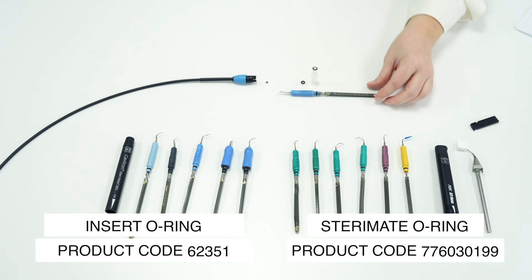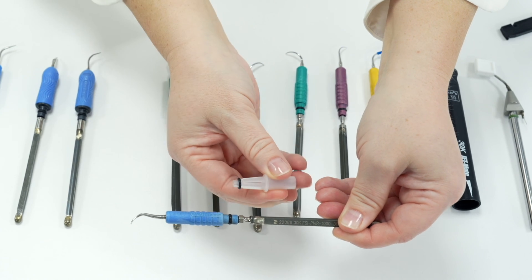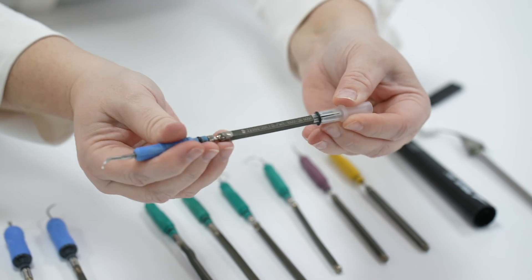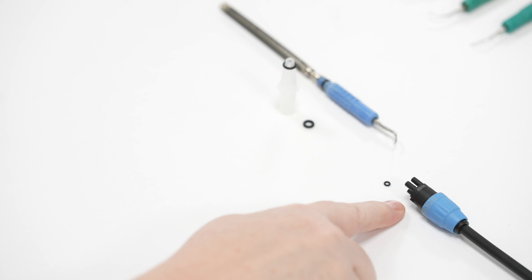If an insert is leaking between the handle and the Stereomate connection, change the O-ring on the insert using the special straw device which comes with it, to avoid splitting the O-ring. If the leaking persists, try changing the Stereomate as the internal plastic will wear down over time. If the Stereomate or JetMate is leaking at the base by the water control, change the smaller waterline O-ring there.